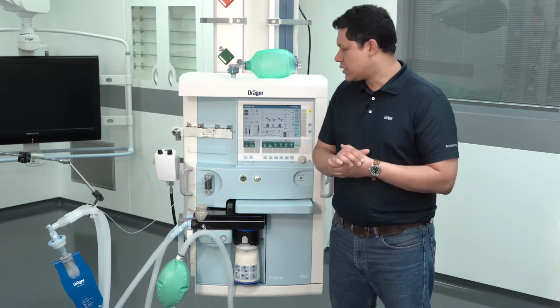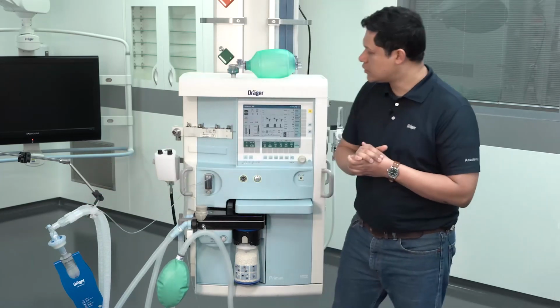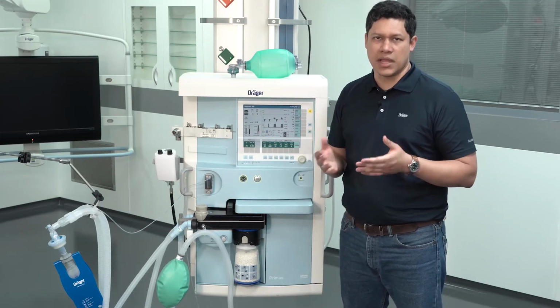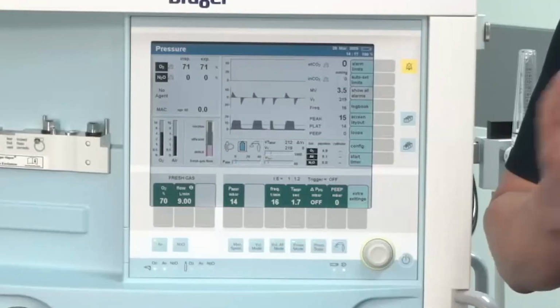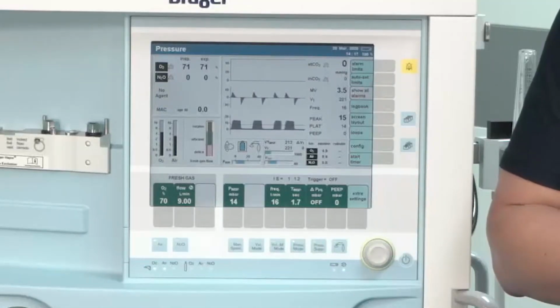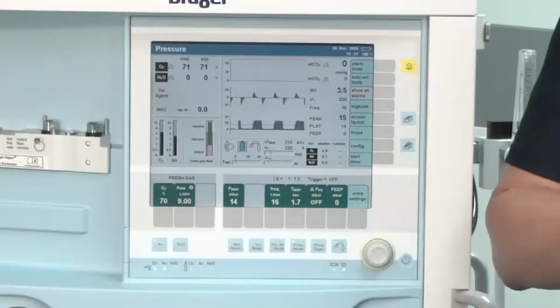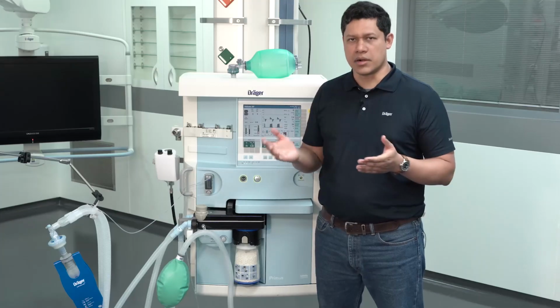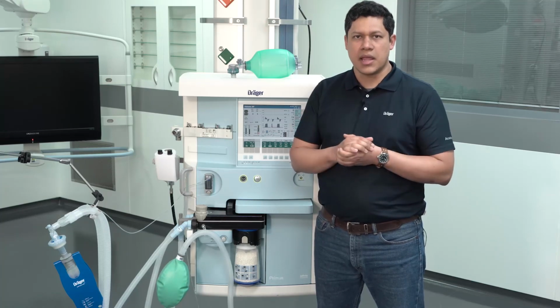Keep in mind that the sample line should always be tightly connected to the patient filter and to the gas measurement water trap, because the measurement of the FiO2 and CO2 is performed by this system. You have to constantly visually monitor the values of the FiO2 and CO2. Because of the rebreathing system, the measured values might differ slightly from the set ones. Be aware that the manual breathing bag should be full and evenly filled, and that it will be moving in synchronization with the ventilation.